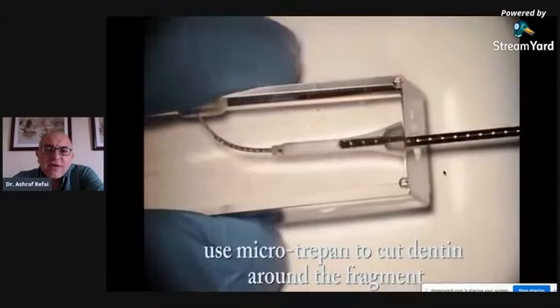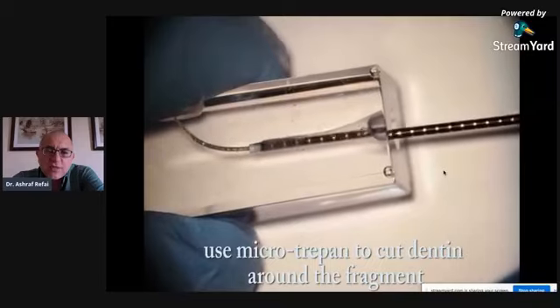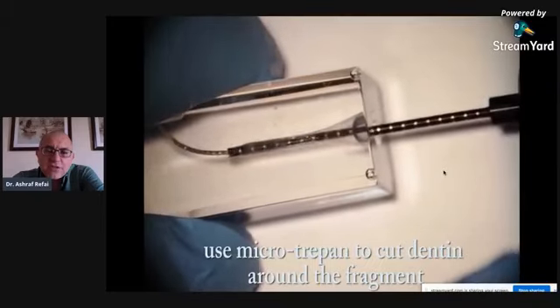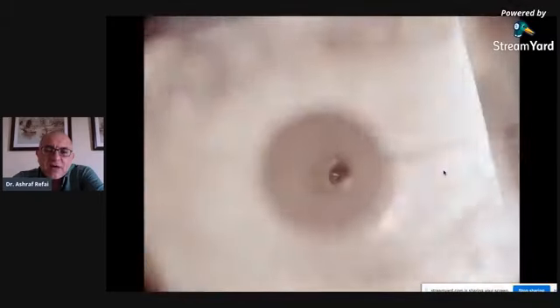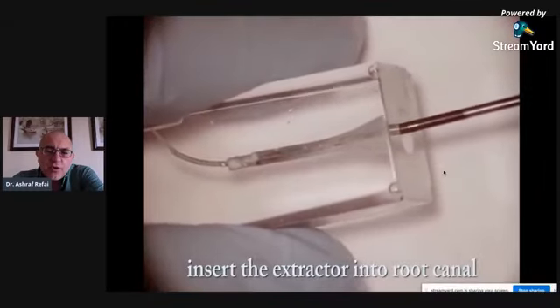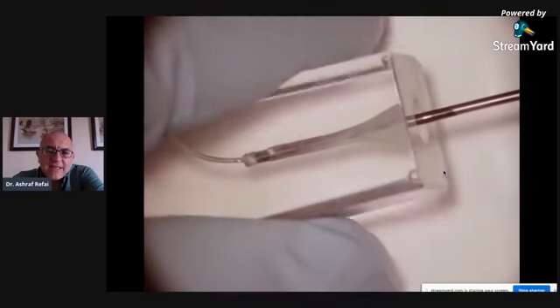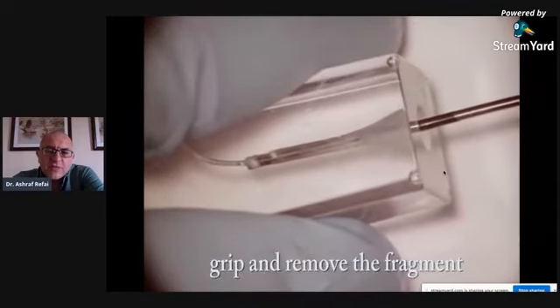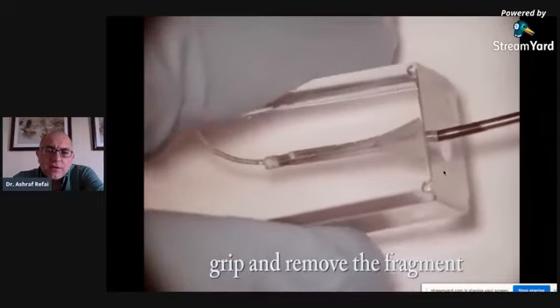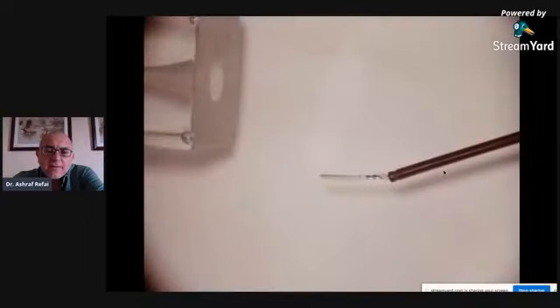Now, you don't necessarily need the trephine drill. You can use ultrasonics to enlarge the space between the canal wall and the instrument, but it takes an immense amount of time. Using these trephine drills, it's much quicker. Here, the tube is inserted, engaged, activated, and the instrument gets pulled out. There you go, see? Because it's become engaged inside. And this is called a tube system.